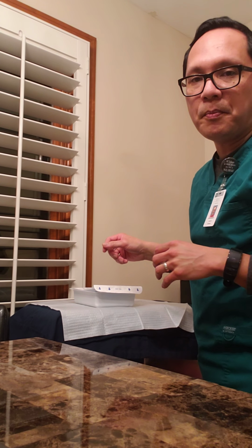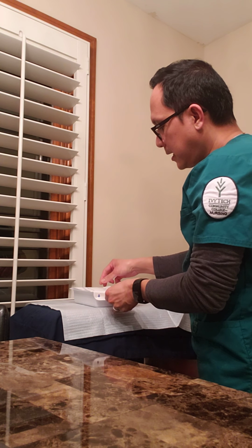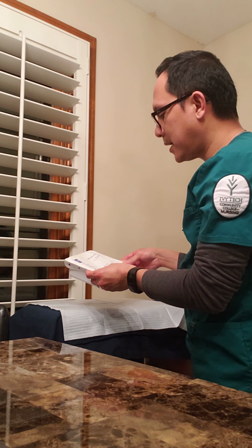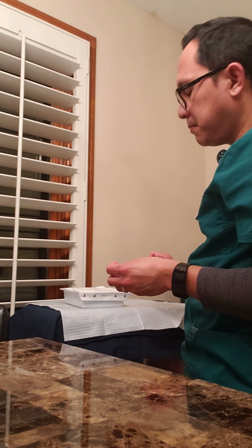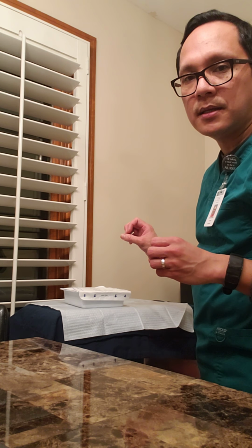Now I'm ready to open my dressing kit. Before I open it, I want to make sure I check the list of contents inside, so I have everything that I'm going to be using. When I open it, I make sure I don't touch the inside because it's a sterile kit.